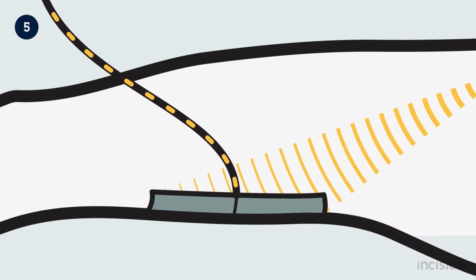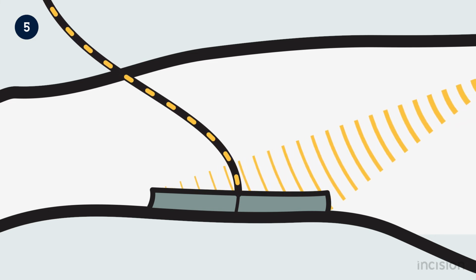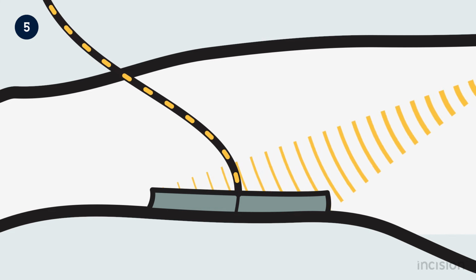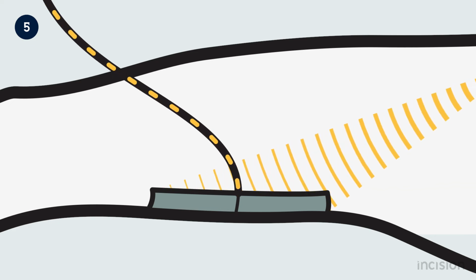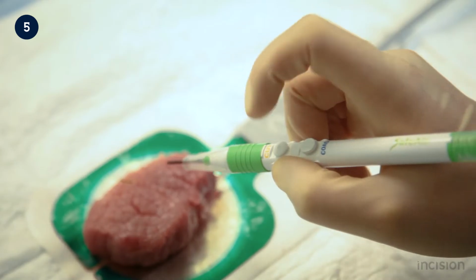The dispersive plate, or electrode, is often incorrectly called a ground pad or neutral electrode. This is incorrect, as the same amount of current is going through the active electrode and dispersive plate when correctly used. The device can be activated either by a foot or hand switch.